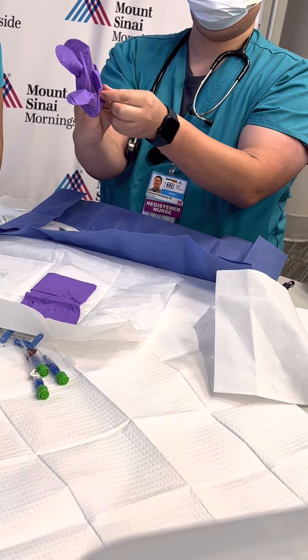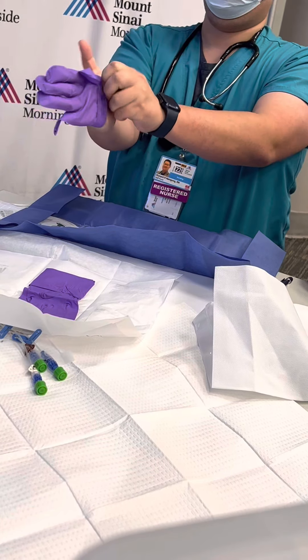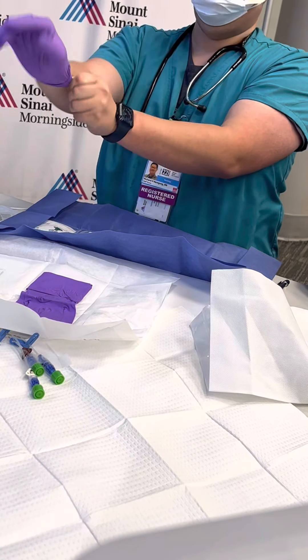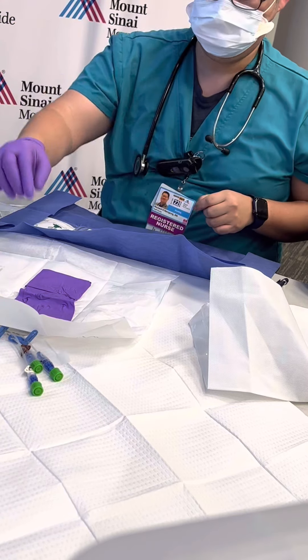It's pretty hard to put on sterile gloves when somebody's watching — I think we all know that. It should be tight like that, because you want to have good dexterity.